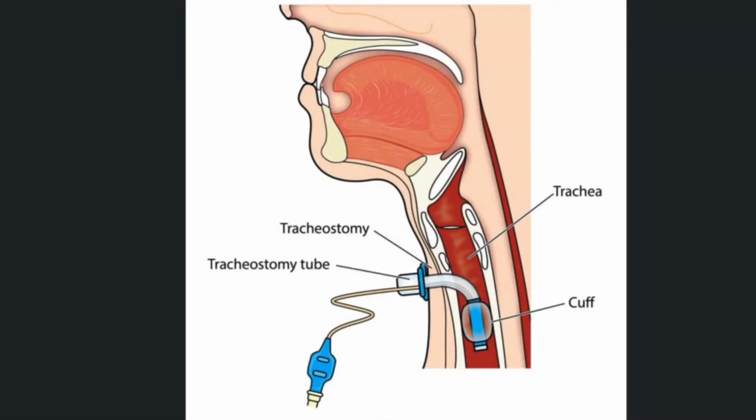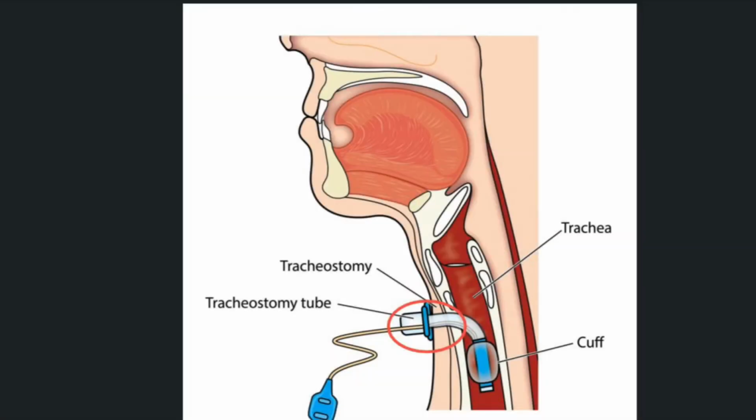Patients with breathing difficulties for a variety of reasons may require a tracheostomy. Tracheostomy involves creating a connection between the windpipe, or trachea, through which one breathes, and the neck. This communication is maintained by having a tracheostomy tube in place to prevent it from closing.